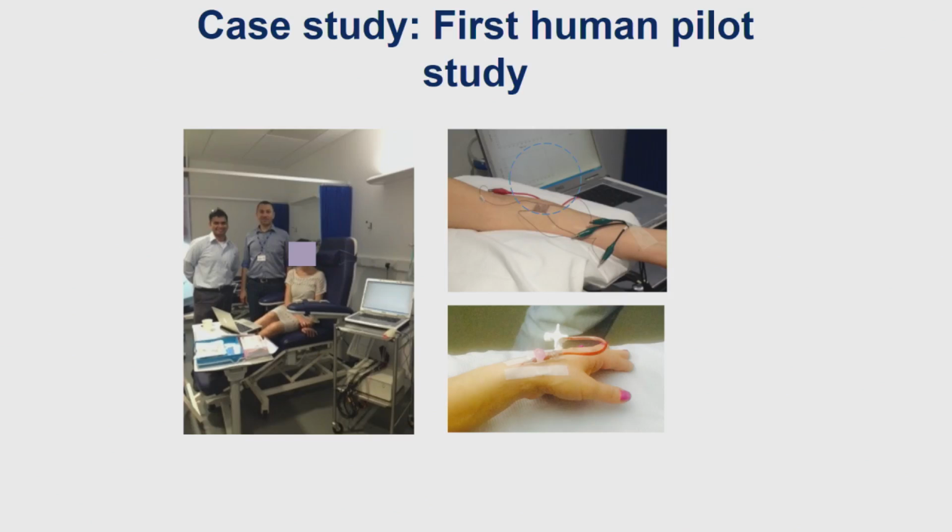So as I said, what are you measuring? You are measuring current. And what are you comparing that against? Glucose values. So you need to have a look at the plot, and you need those points there. If you remember from the animal studies, I showed you an enlarged view wherein you had the bolus and you saw a postprandial peak. You saw the capillary blood readings in between there, and by looking at the capillary blood readings going up and down and the trends that you see in your plots, you can see if you are able to capture the events.